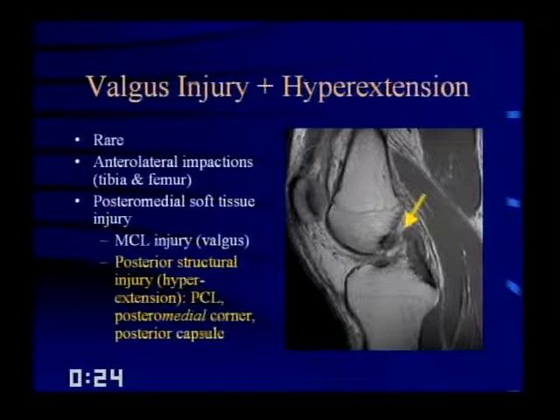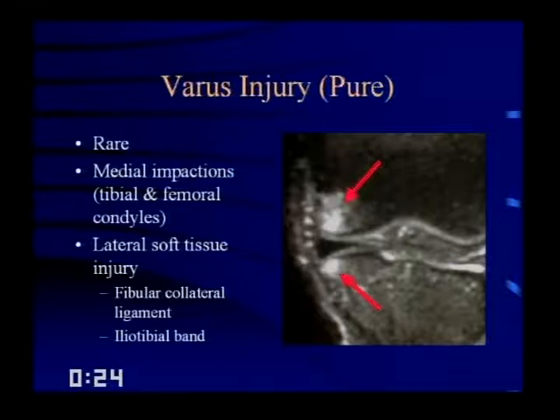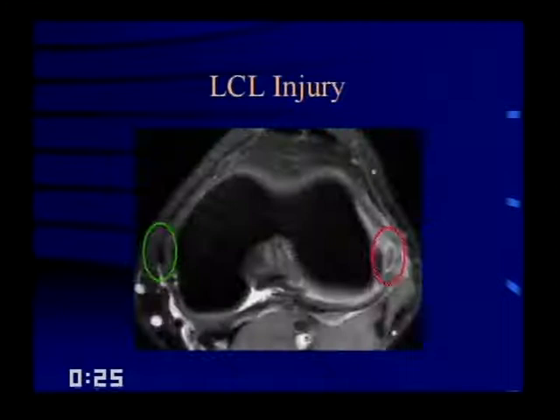Varus injuries are less common than valgus injuries. A pure varus injury is particularly uncommon, seen almost exclusively in wrestlers. You get medial impactions of the tibial and femoral condyles — opposite of a clipping injury — so look for lateral soft tissue injury. The fibular collateral ligament may show abnormal signal within and around it, as confirmed on axial images showing the lateral collateral ligament with abnormally high signal compared to a normal medial collateral ligament on the same side.